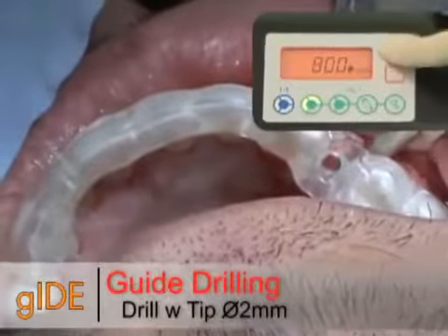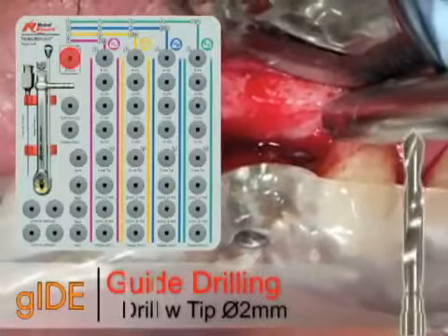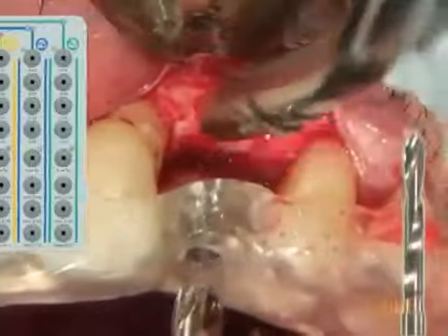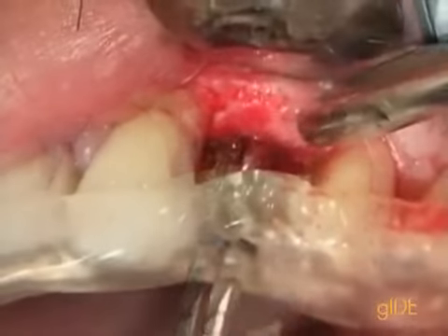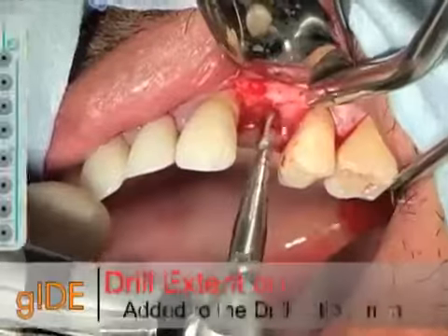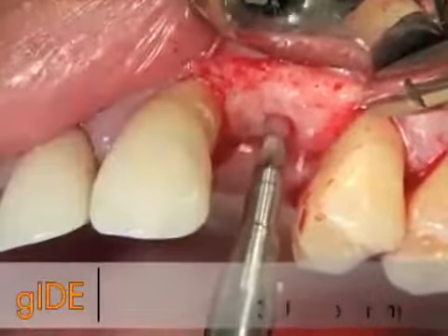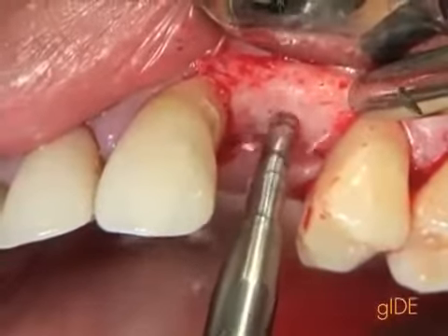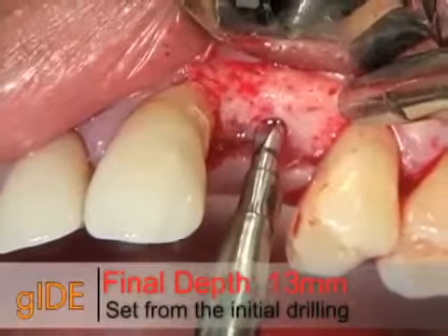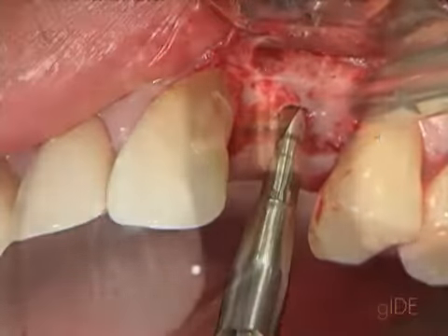The drill is used at 800 RPM, and it's guided through the stent into the optimal prosthetic position, which was chosen by pre-surgical diagnostics. Then an extension is added to the 2 millimeter drill, and is guided into position to the optimal length of 13 millimeters, which is the final depth for the implant which was chosen.